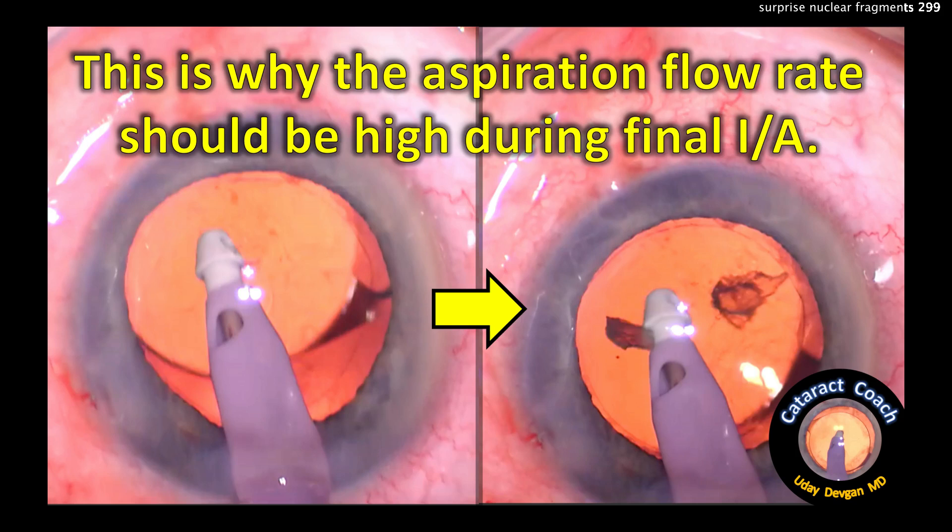cataractcoach.com. This is the reason why your aspiration flow rate should be very high during final irrigation aspiration.